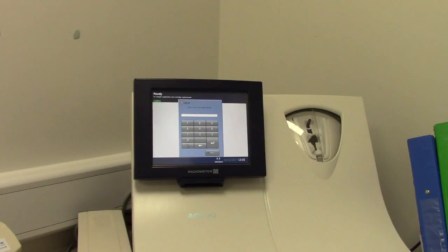The Radiometer AQT90 Analyzer can process procalcitonin tests on whole blood or serum in 20 minutes. Samples do not need to be spun, which saves time. It will give you a printed numerical result and store the result on the analyzer.